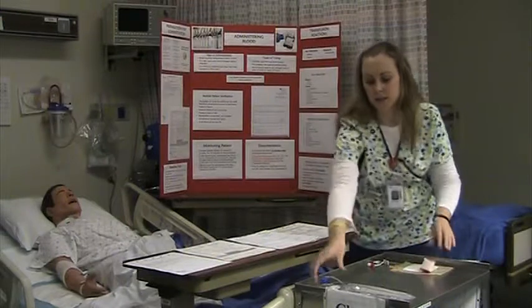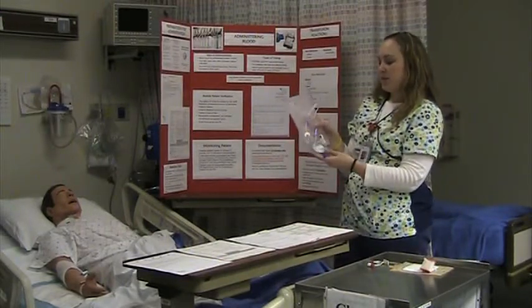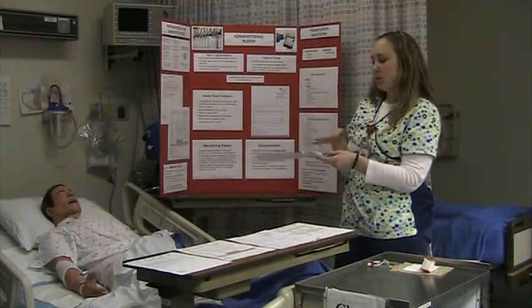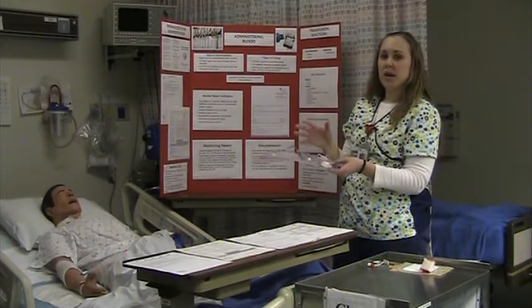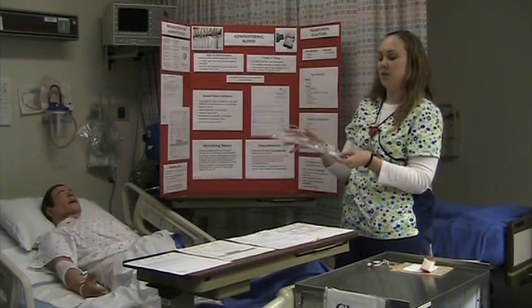And then the last tubing here we have is a blood warmer. This is only seen in the ICU as well. It inserts into this little machine that warms the blood so that if it needs to be given really fast, the cold blood that comes from the lab isn't shocking the patient because it's so cold being given so fast.